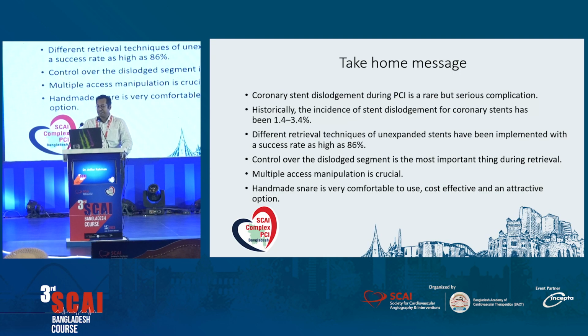So, coronary stent dislodgement during PCI is a very rare but serious complication. The incidence is 1.4 to 3.4%. Different retrieval techniques for unexpanded stents have been implemented with a success rate of about 86%. So control over the dislodged segment is the most important thing to get success.